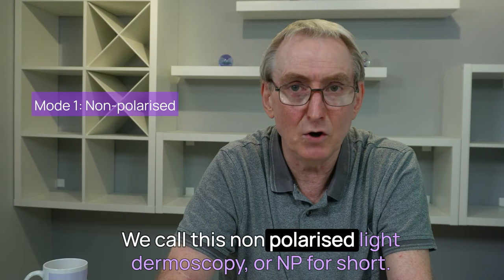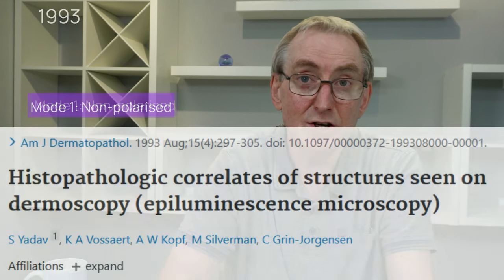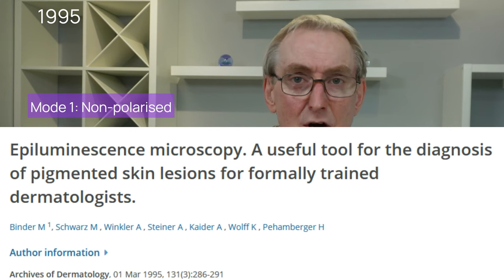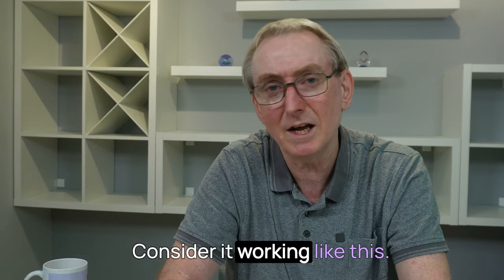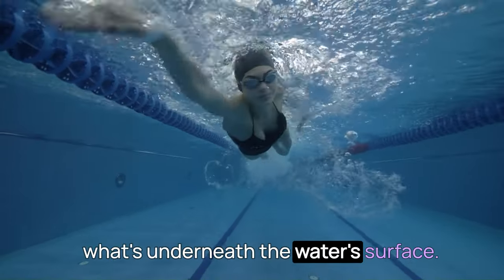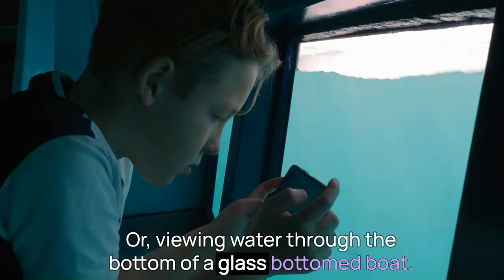We call this non-polarised light dermoscopy, or NP for short. Studies showed it was a great tool to improve the recognition of skin lesions and confirmation that what you see using a dermoscope does correlate with histology. Consider it working like this: when swimming, you put goggles on and can get a clearer picture of what's underneath the water surface, or viewing water through the bottom of a glass-bottomed boat.